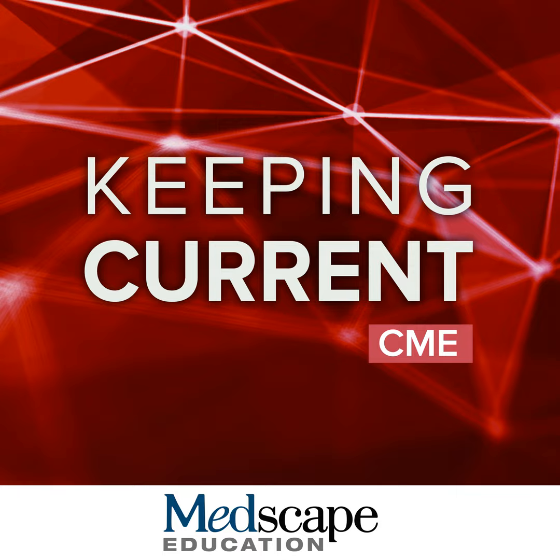All right. Next question is one we get all of the time. So this is regarding the MRI scans. As most of you know, we're going to see more microhemorrhages at 3 Tesla than at 1.5 Tesla. We're also going to see more microhemorrhages if we perform our sensitive sequence like susceptibility weighted imaging, versus the gradient echo or T2 star type approach.